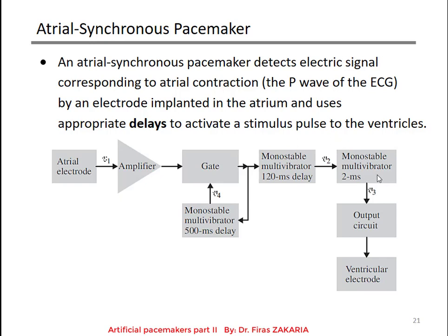So it also acts as a delay, allowing the ventricular stimulus pulse V3 to be produced 120 milliseconds following atrial contraction. This is just a small delay of 2 milliseconds.